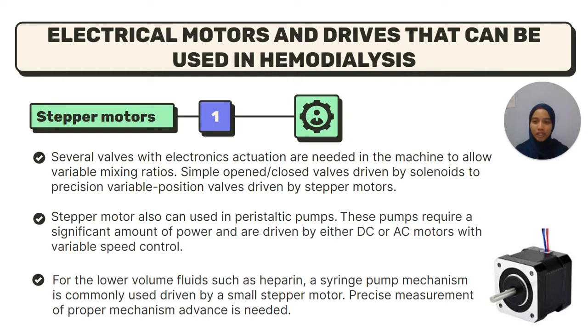This pump requires a significant amount of power and is driven by either an AC or DC motor with variable speed control. For lower volume fluid such as heparin, a syringe pump mechanism is commonly used, driven by a small stepper motor. Precise measurement of the mechanism advance is needed in hemodialysis.